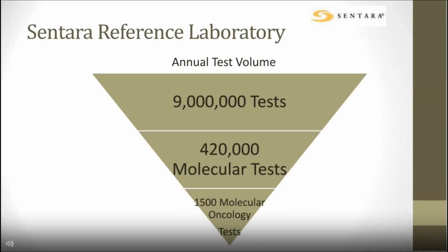Within our laboratory, our annual test volume is over 9 million annual tests that are conducted in our integrated laboratory here in Norfolk. Of those, approximately 420,000 are molecular-based tests, and of those 420,000, approximately 1,500 are molecular oncology-based.